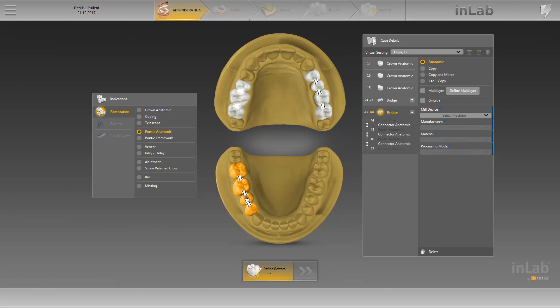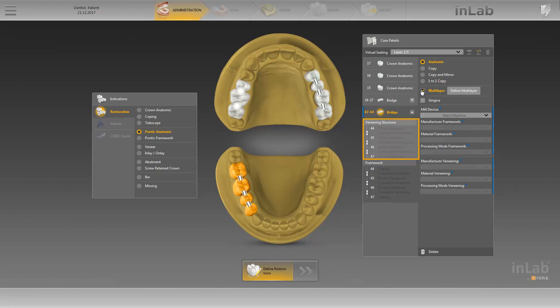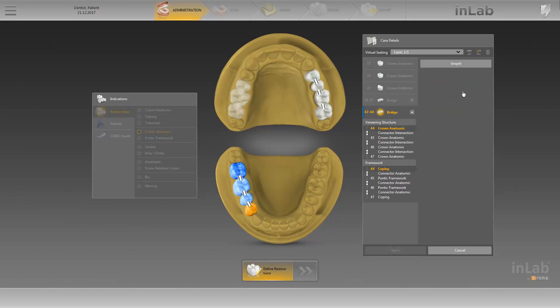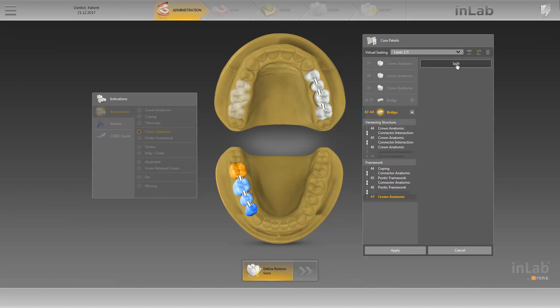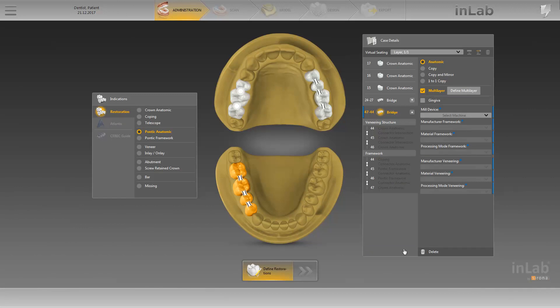We now want to change this bridge into a multi-layer bridge. To do so, we go to the case details and activate the option multi-layer. The bridge is now divided into a veneering structure and a framework. Let us assume that the structure on 4-7 should not be divided into a multi-layer structure due to a lack of space in relation to the antagonist. By clicking on define multi-layer, it is possible to select the restoration on 4-7 and convert it back into a full anatomic crown by clicking on unsplit. This needs to be confirmed by clicking on apply. We also have the option to select a separate gingiva element for the bridge, and its design can be edited as an additional construction element. This option is available for all bridges on stumps and implants, and can also be combined with the multi-layer option.